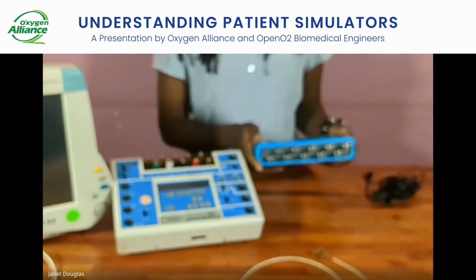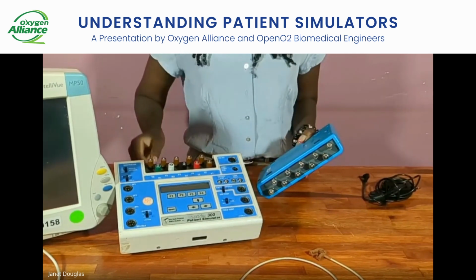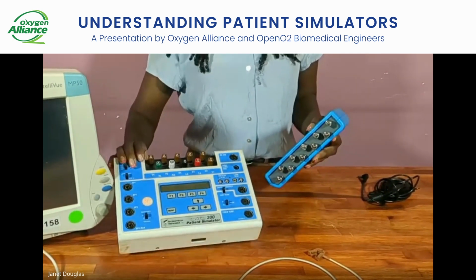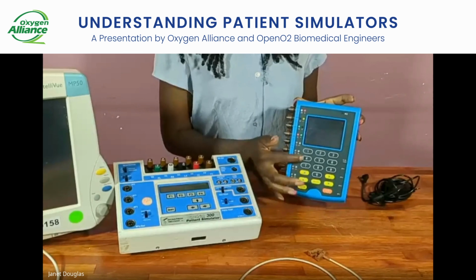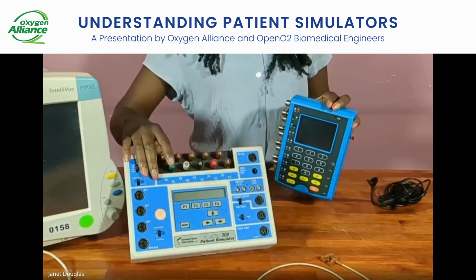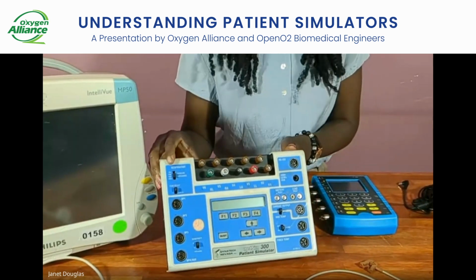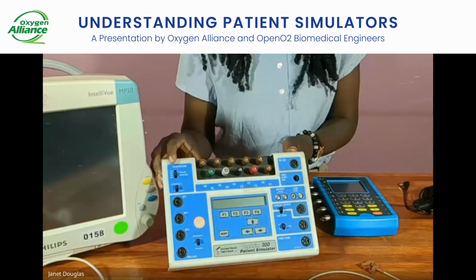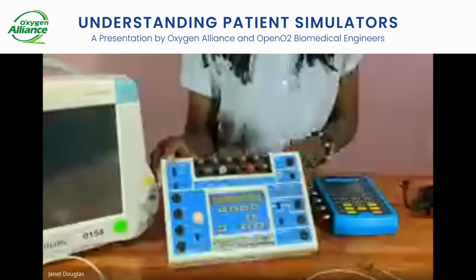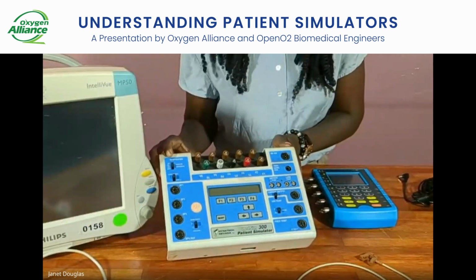Every multi-parameter simulator will have an ECG connector or ECG connectors. For these brands, these are the ECG connectors. And also you have a keypad where you can navigate. For this brand, the keypad is where you're seeing the arrows and the F1 up to F4. These function keys help you to select what you want to simulate or which area you want to go through on the LCD.